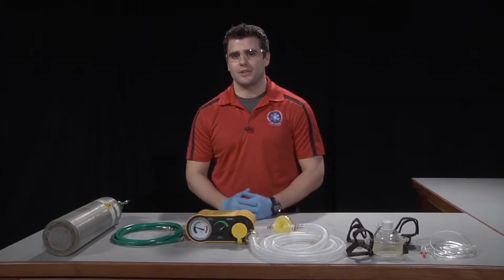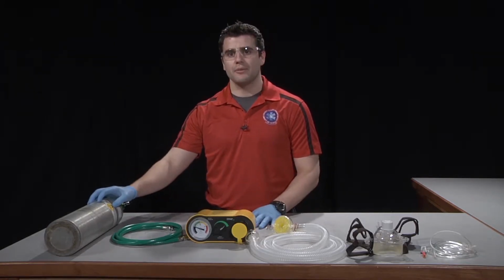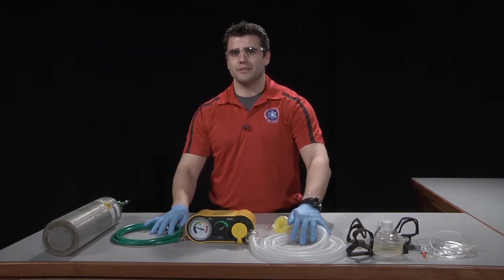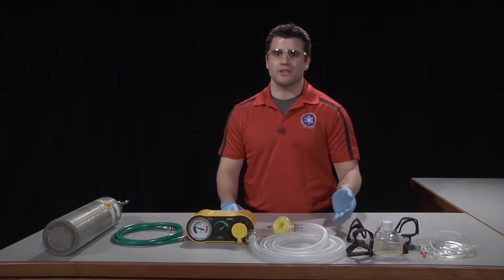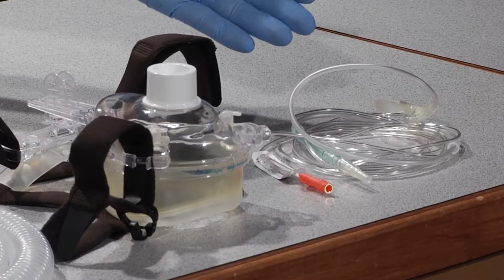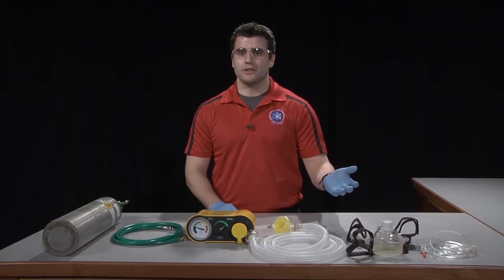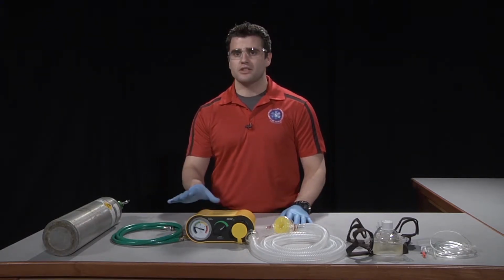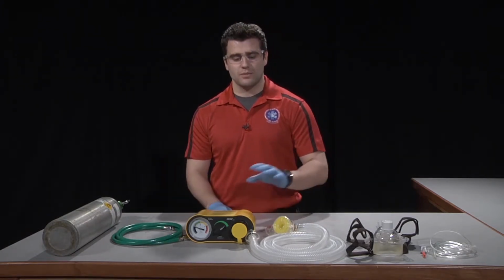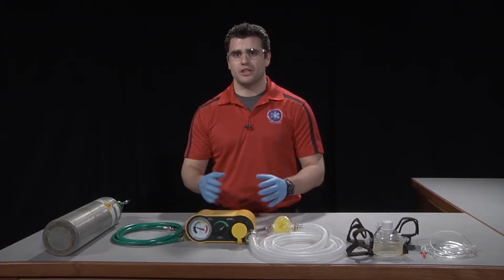Now we're going to gather and assemble our equipment for CPAP. The equipment that we'll need is an O2 supply, hoses and tubing, a CPAP machine, our CPAP mask with head straps, and our EtCO2 nasal cannula. From there, we're going to coach our patient on how to use the CPAP mask. We'll then attach our oxygen supply to the CPAP machine as well as the breathing portion to the CPAP machine, and then turn on the O2 and the machine.